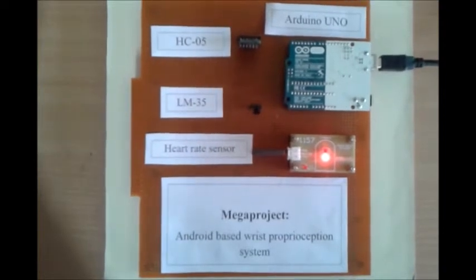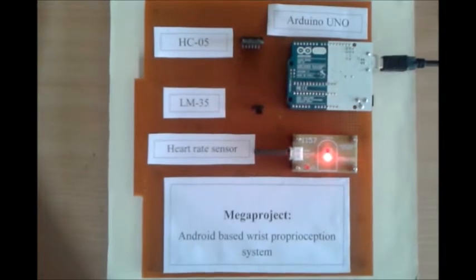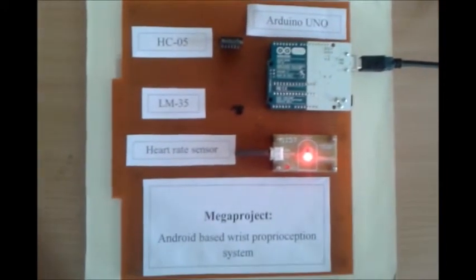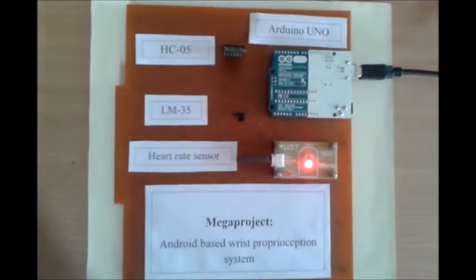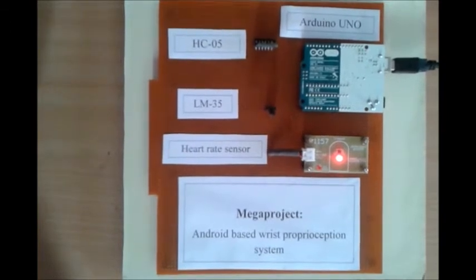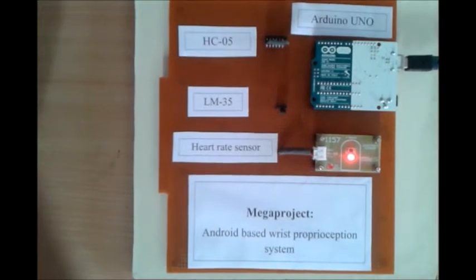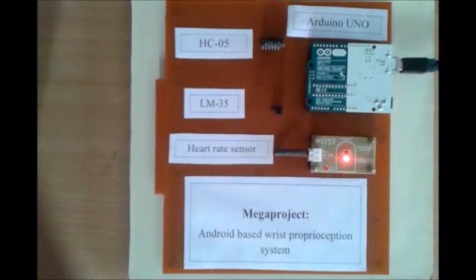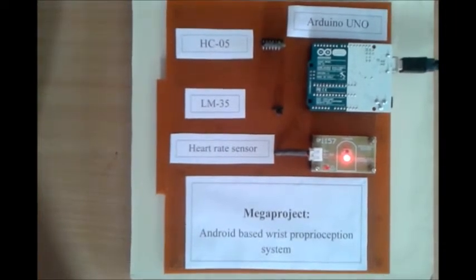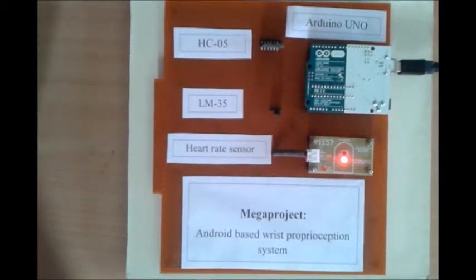This data is gathered in the analog pins of Arduino. Pin 0 of Arduino is assigned for the pulse sensor and pin 5 of the Arduino is assigned for the temperature sensor. The raw data is processed in Arduino. In Arduino, temperature and the signal are stored in separate variables. The signal of LM35 is converted into temperature by a formula. The formula is: the digital value is multiplied by 5 and 100 and then divided by 1024.